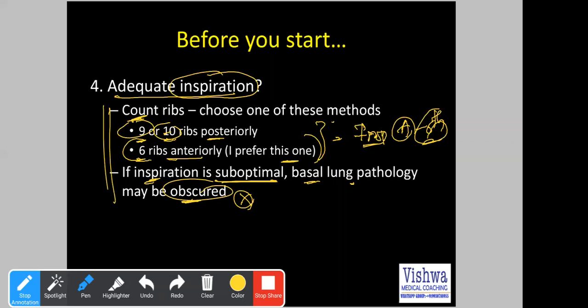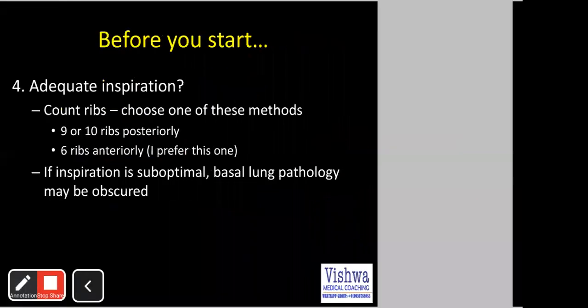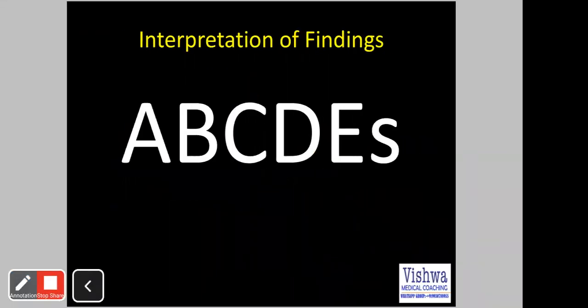So before you start, these things are important: exposure, centralization, inspiration, position, right or left. All those things need to be checked, and also, of course, the name and age of the patient. Okay, let's call it a day.